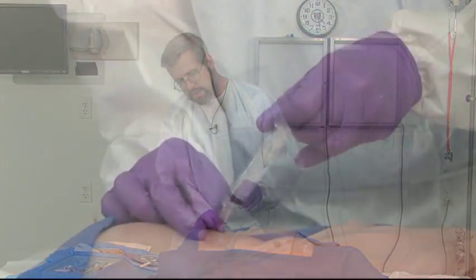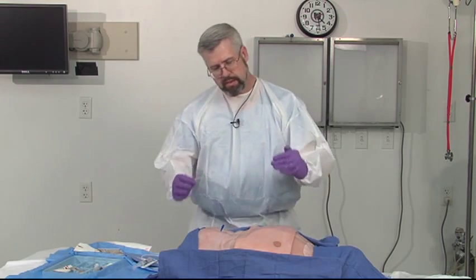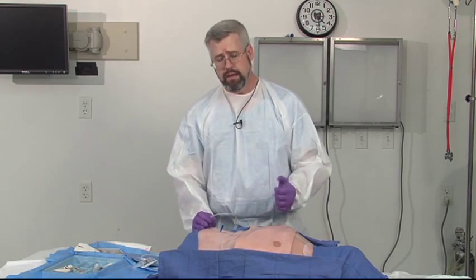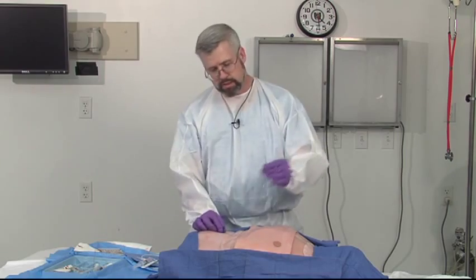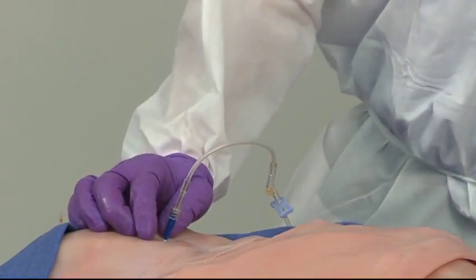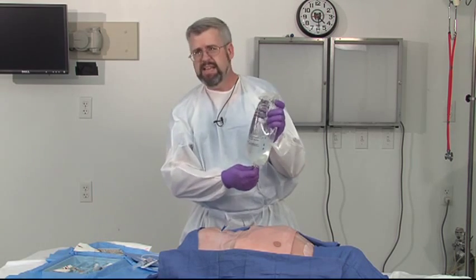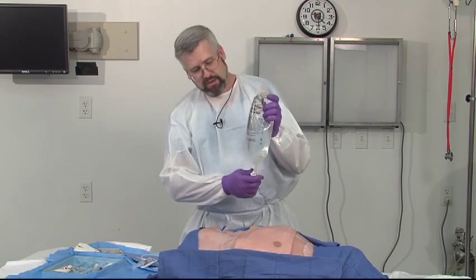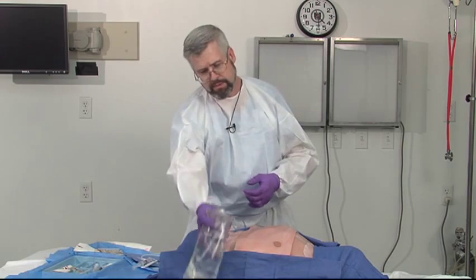If in fact I had gotten no blood out, the technique is to put fluid into the abdomen. You're going to take warm saline — you want to use warm saline because you don't want to make the patient hypothermic. Generally this is going to be based on the patient's weight; if you have a small patient, you don't want to put the entire liter in. Generally you're going to use about 10 cc's per kilogram, so for the average 70 kilogram man, you're going to use about 700 cc's. You put the saline in, but be careful: if you let all the fluid go in, you're not going to be able to get it out — similar to siphoning, you need some fluid remaining in the tube. So put in about 700 cc's of this warm saline, then drop the bag to the floor and see how much fluid comes out after you've sloshed it around inside the abdomen.